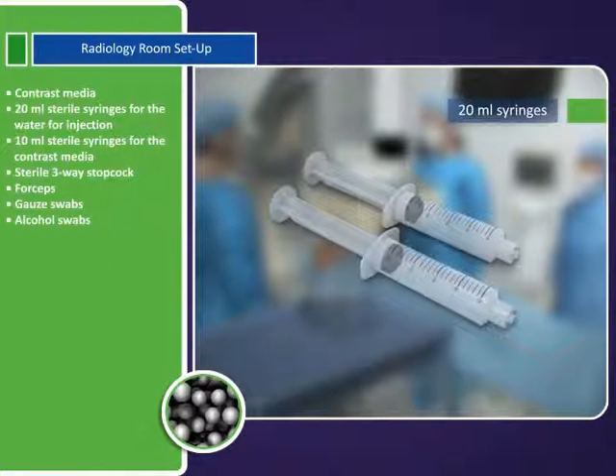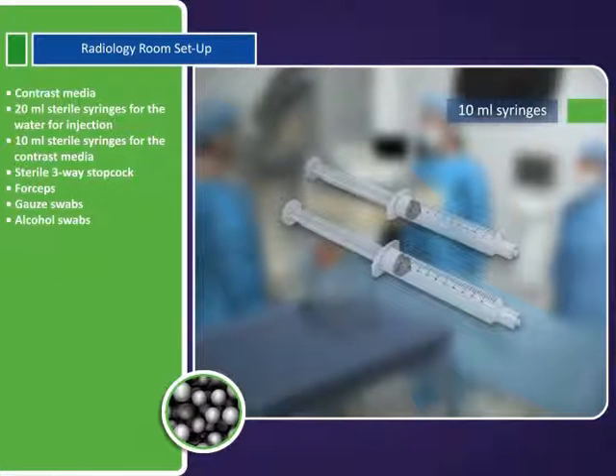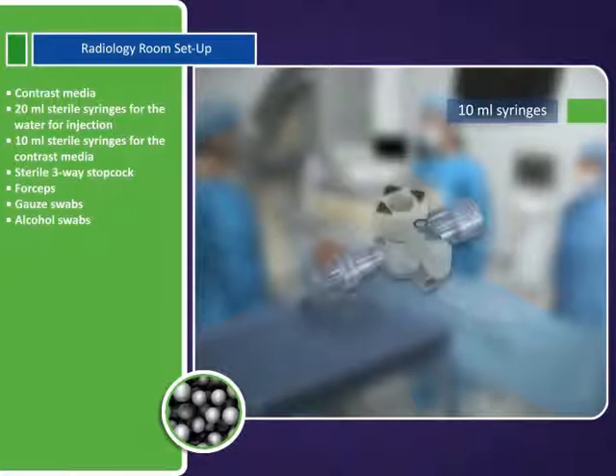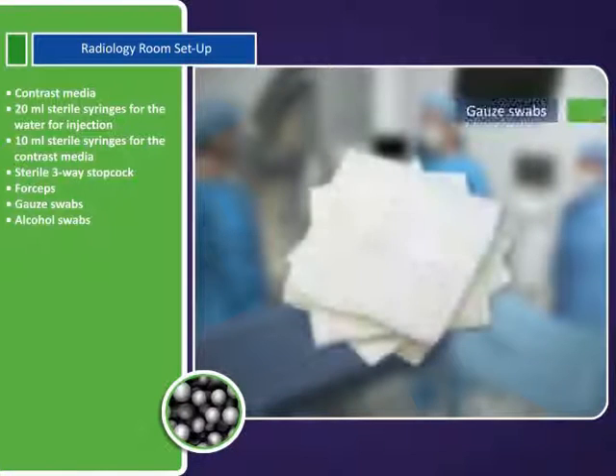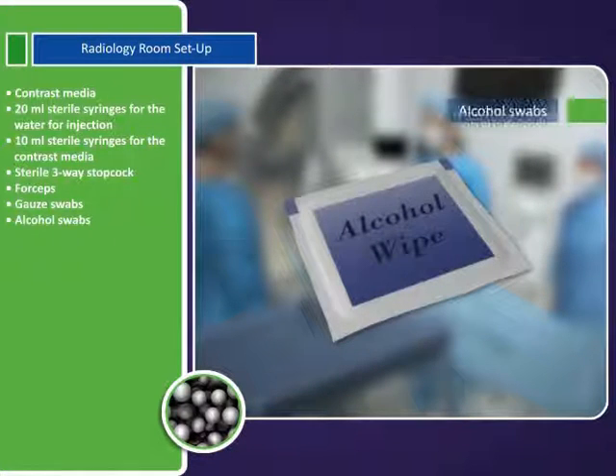Sterile water for injection. Contrast media. 20-milliliter sterile syringes for the water for injection. 10-milliliter sterile syringes for the contrast media. Sterile three-way stopcock. Forceps. Gauze swabs. Alcohol swabs.